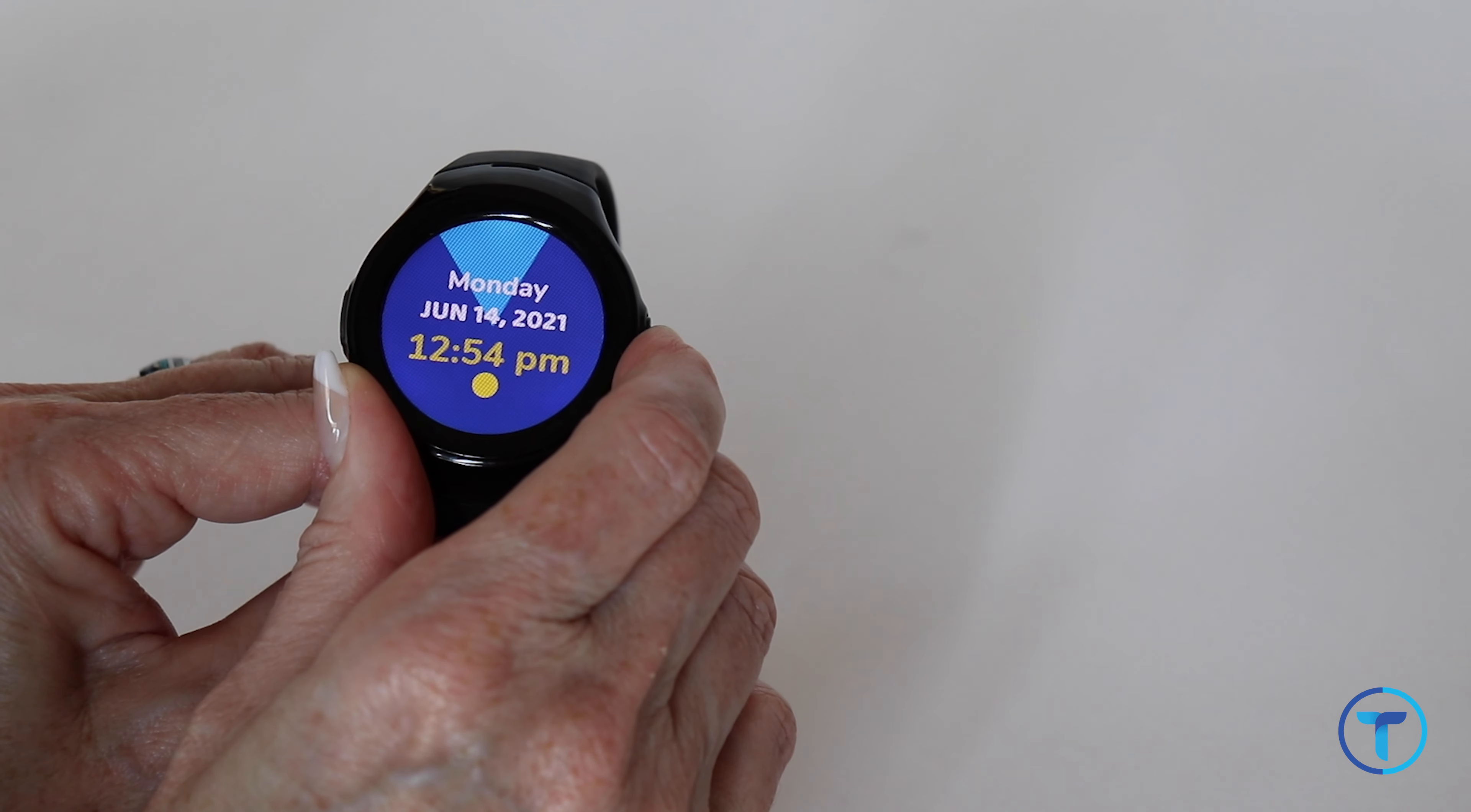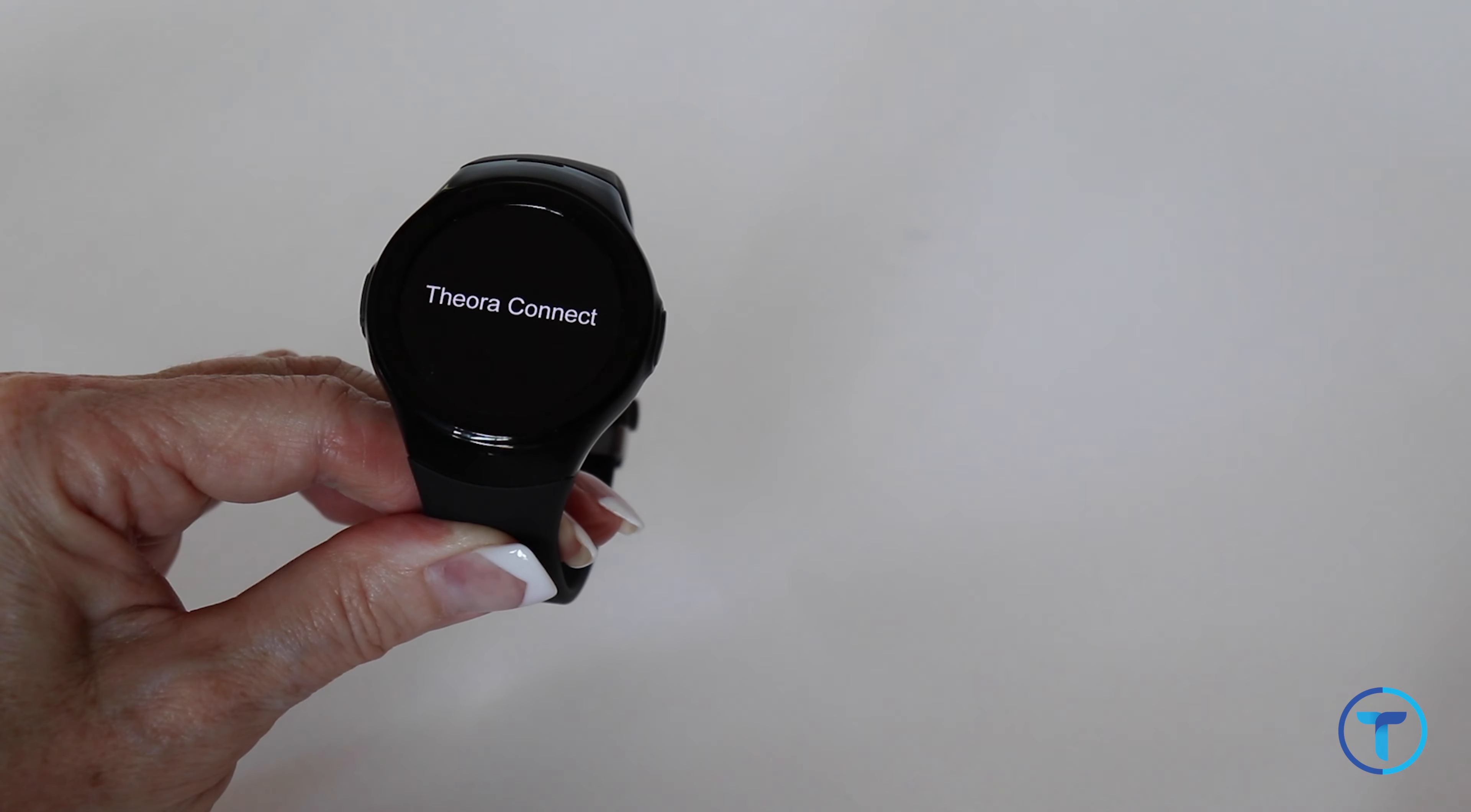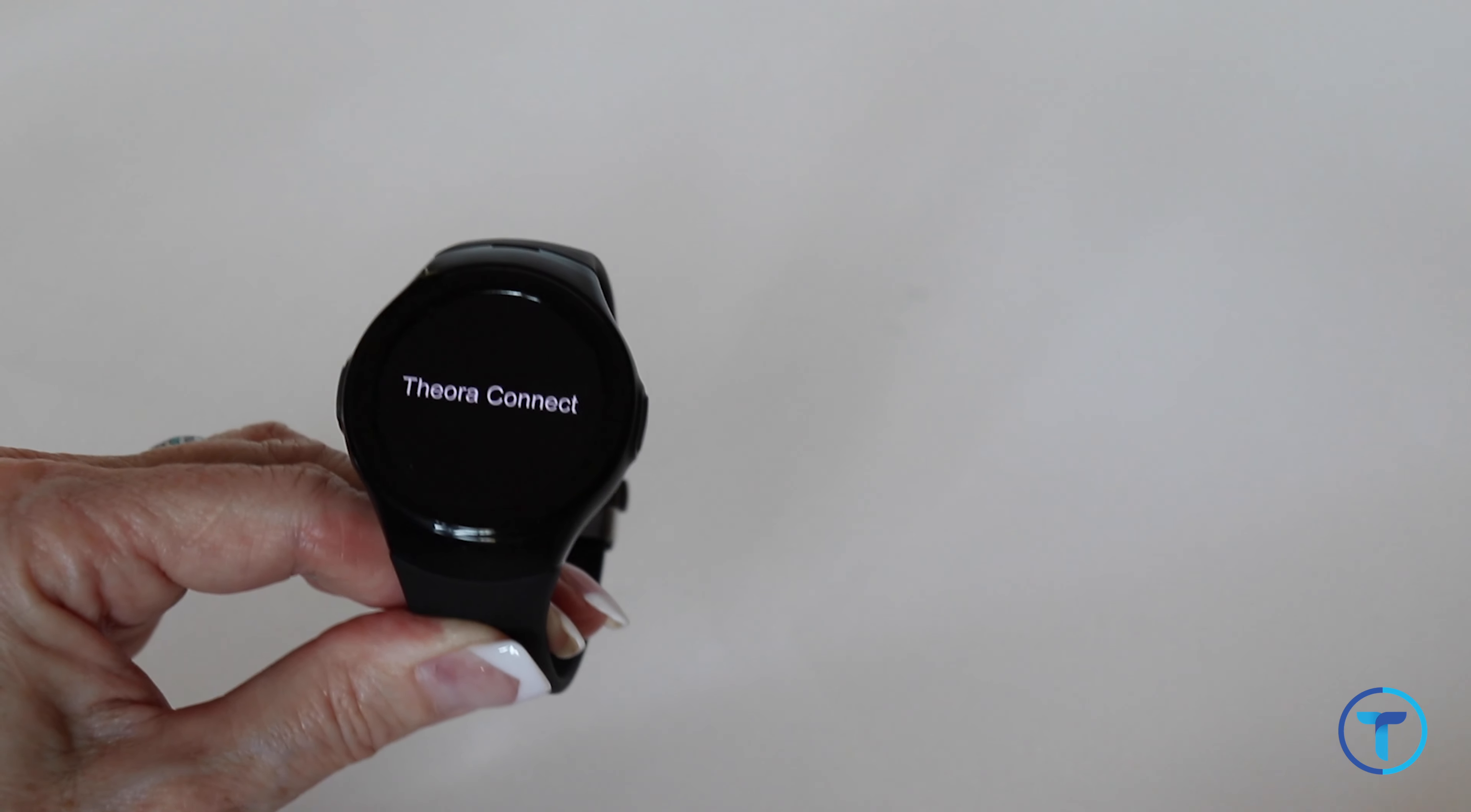To get out of lockdown mode, press and hold the on off button to get it to reboot. Once you see the OR Connect pop up, you can release the button. The watch will automatically reboot.